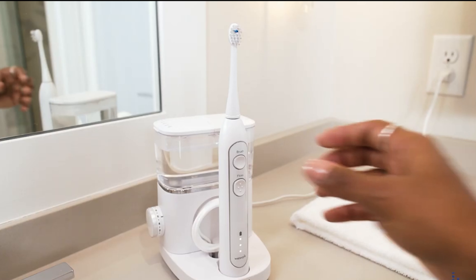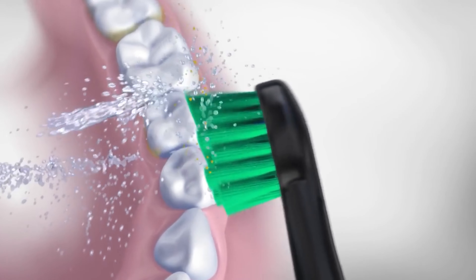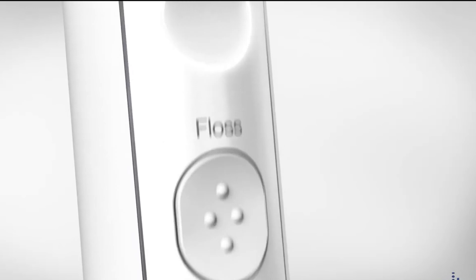So here are the pros. Firstly, the most obvious pro is the cleaning efficiency that the Waterpik Sonic Fusion provides, enabling you to save time by brushing and flossing simultaneously. The push of a button enables you to switch between the three modes: brush, floss, or brush and floss.